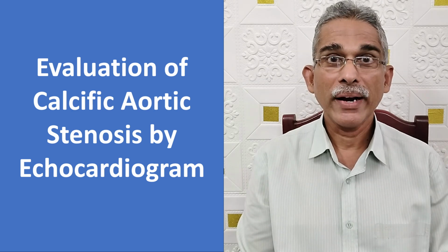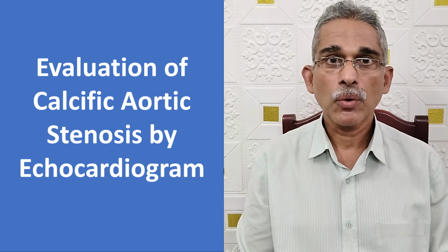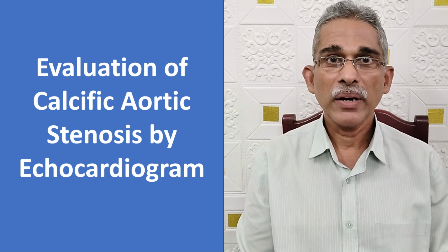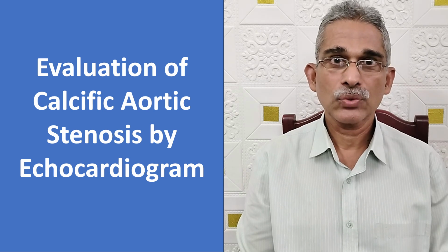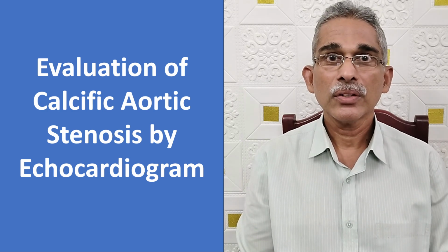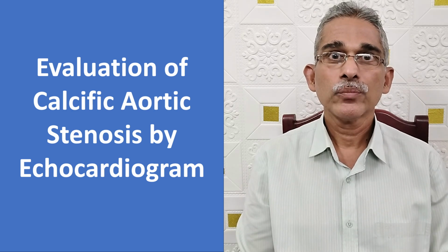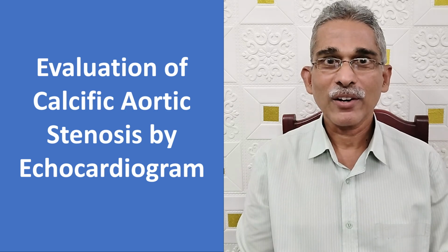Echocardiography is a widely available tool for detection of aortic stenosis as well as quantification of severity of aortic stenosis, determining the morphology of the valve and aortic gradient as well. It assesses left ventricular function and thickness. So there is a very important role for echocardiography. Let us see how calcific aortic stenosis is evaluated by echocardiogram.